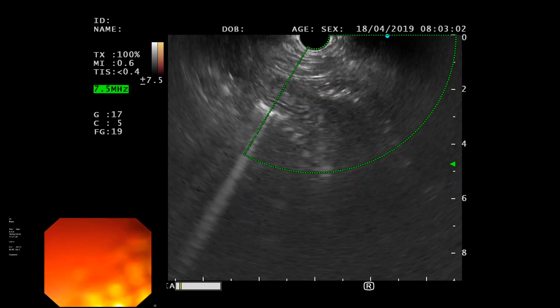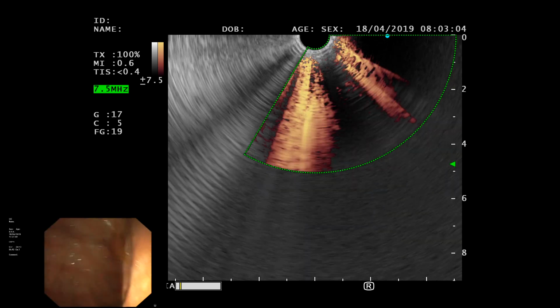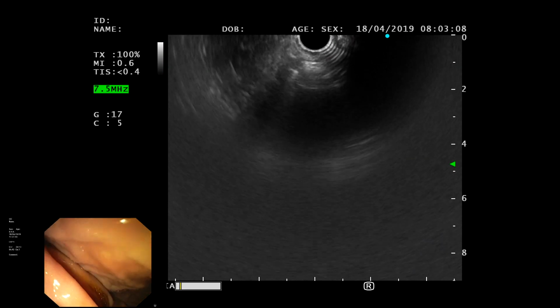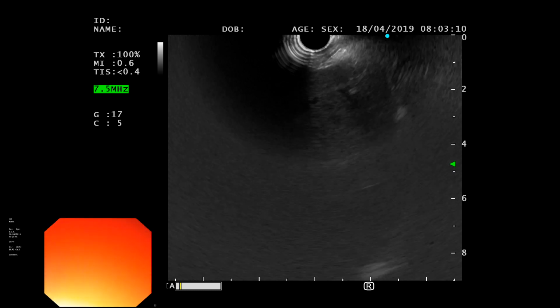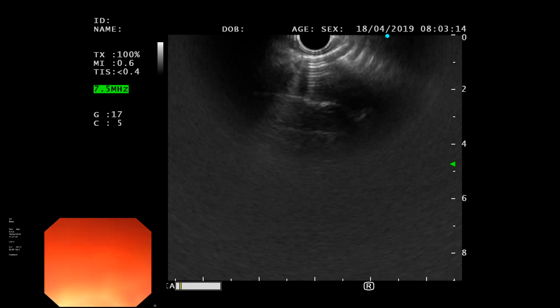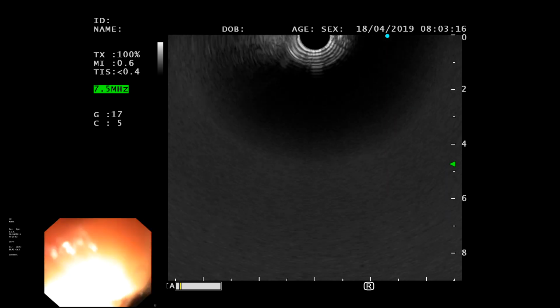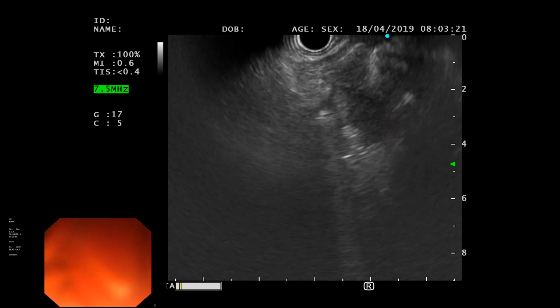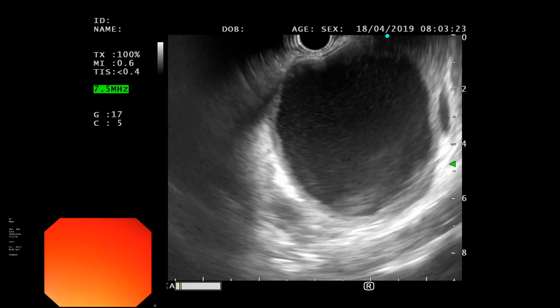I think we're not going to gain much more from this case. But one thing I want to do is, let's see if I can quickly show you the left adrenal. Right, 2 things. Could you also measure the cyst, if that's okay? And secondly, Dr. Ras was wondering if we can look at the CT after you're done, if we have the images of the CT scan.